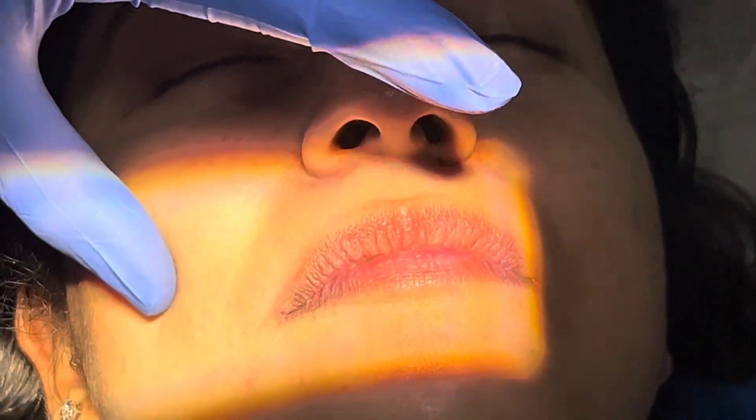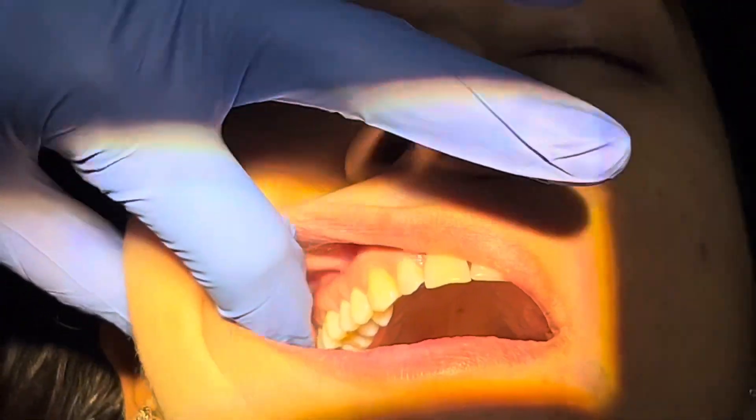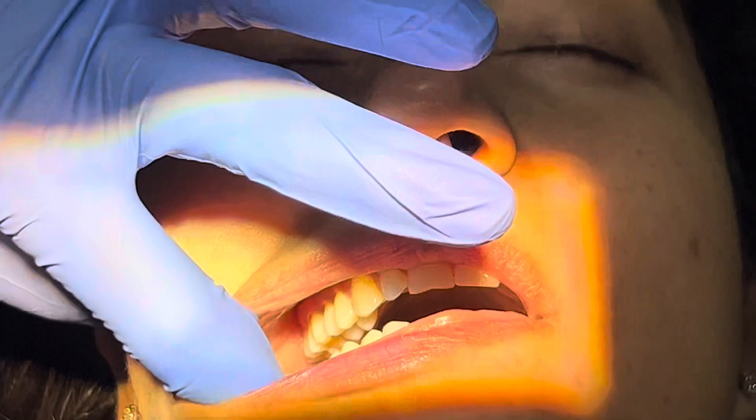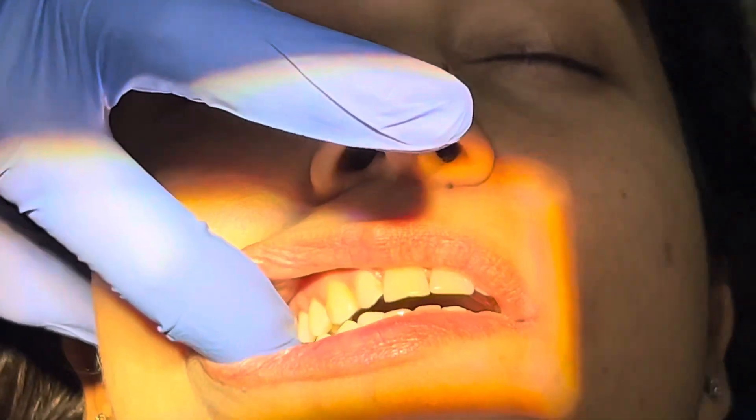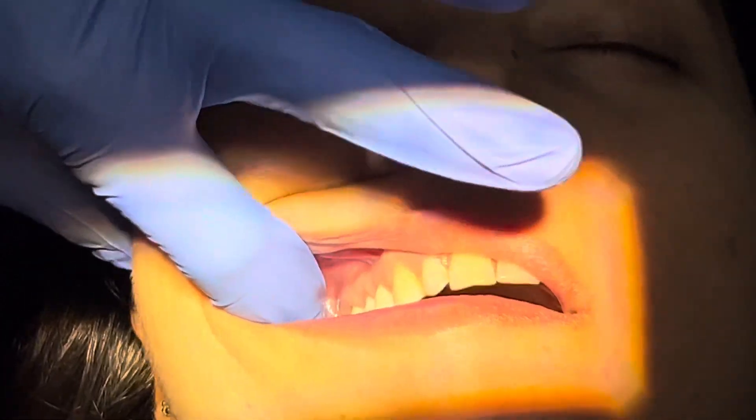For the posterior superior alveolar nerve block, or the PSA, we ask the patient to open the mouth — and the mouth is not to be opened very wide. Just close down a bit, open a little bit, yes. So this is the amount of mouth opening we need.